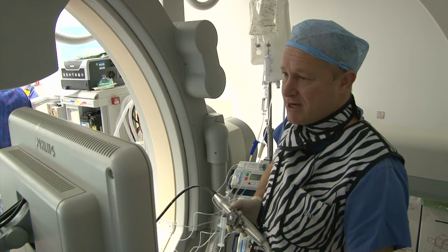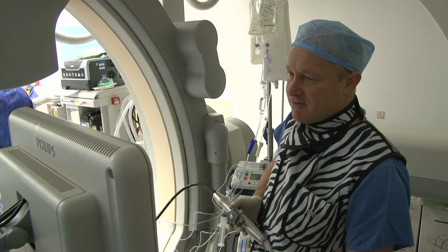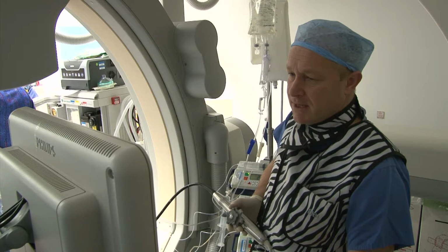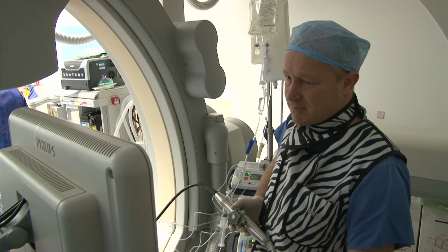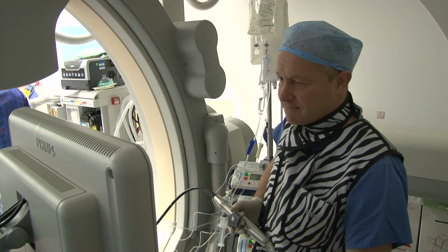reverberation artifact. There is a problem here because our pre-test assessment has suggested a valve annulus of 23, and actually on this I think that these are probably underestimated, partly because of the reverberation artifact.